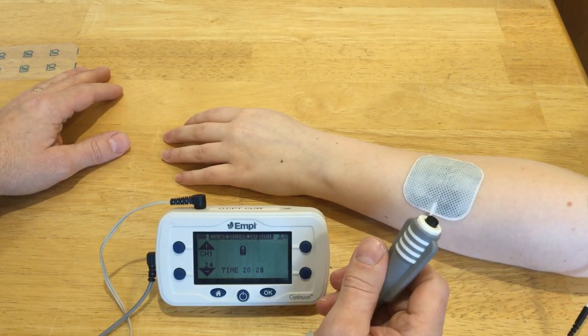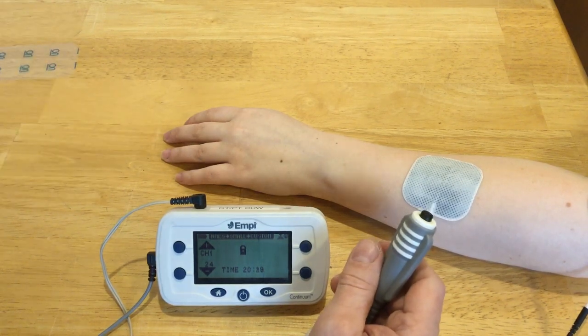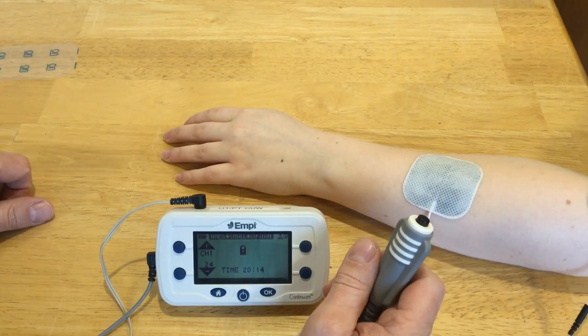This is a situation where you might do it in the arm. In the leg, it's typically done with foot drop. If somebody can't dorsiflex their foot very well, they may have a heel switch in their shoe — when they heel strike, it stimulates them to dorsiflex so they don't catch their toe.